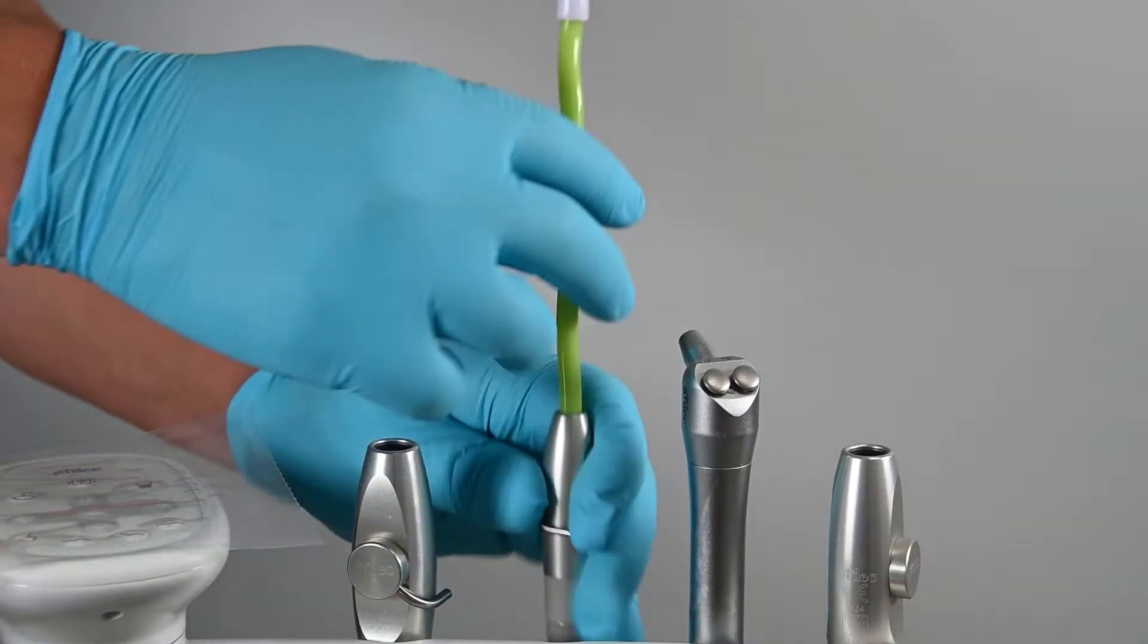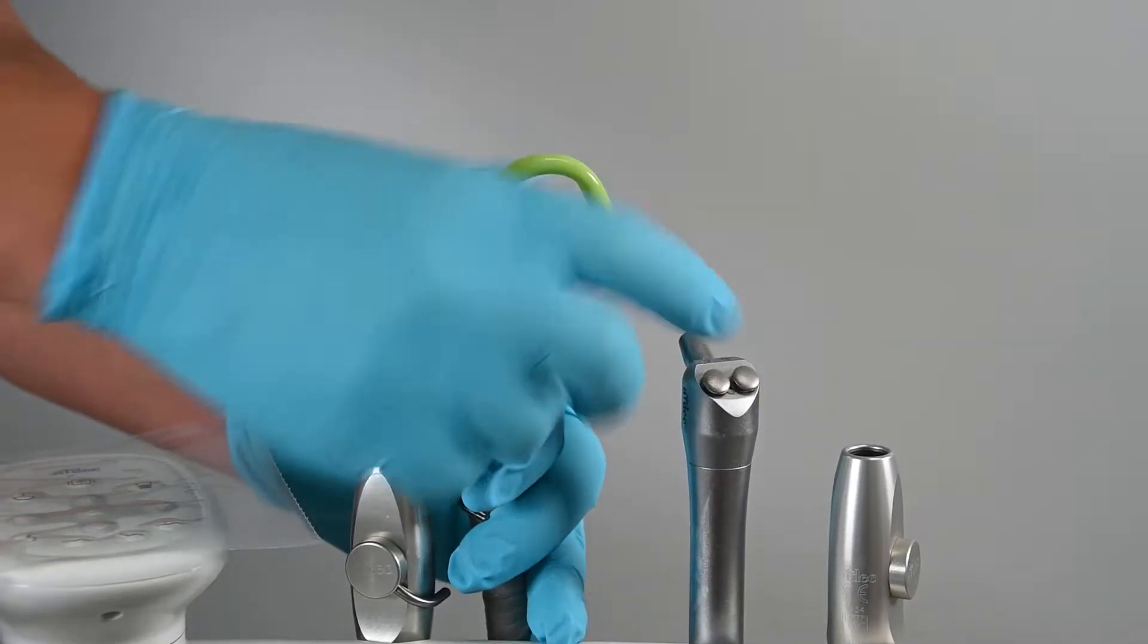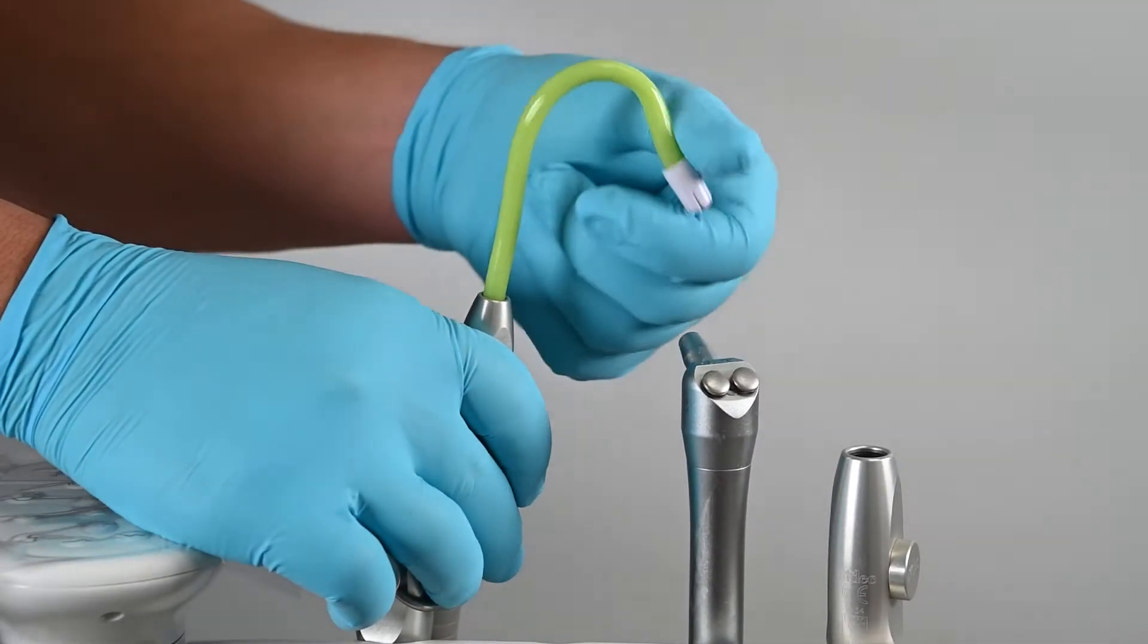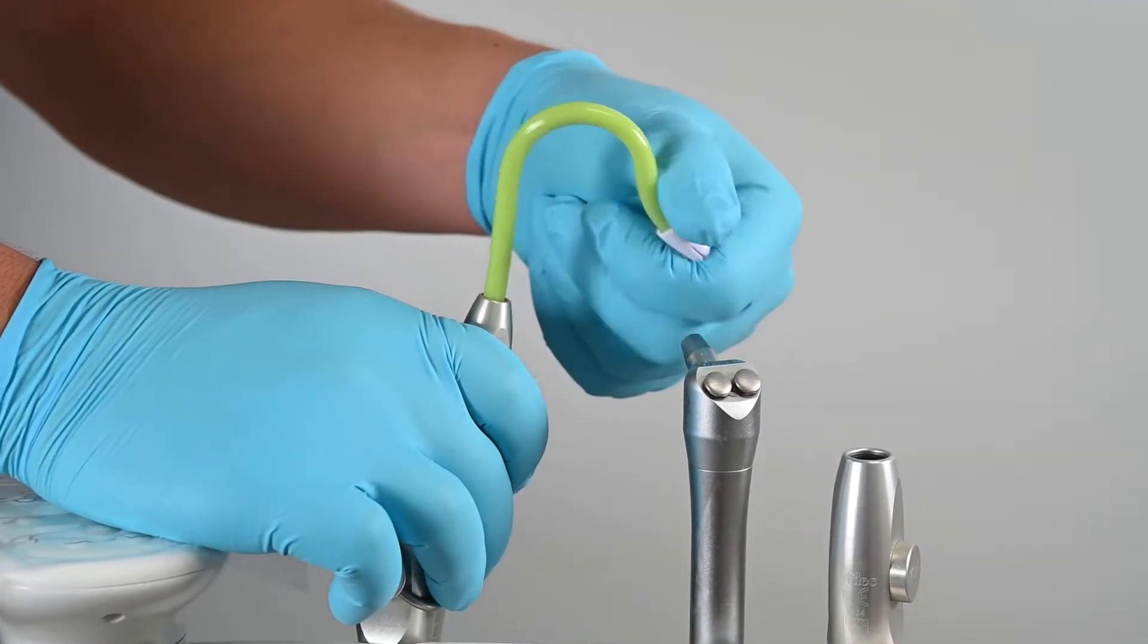When working with only a saliva ejector, a proper position can be achieved by creating two bends on the body. The first bend is to anchor the saliva ejector to the lip, and the second bend is to angulate the tip to remove intraoral fluid.